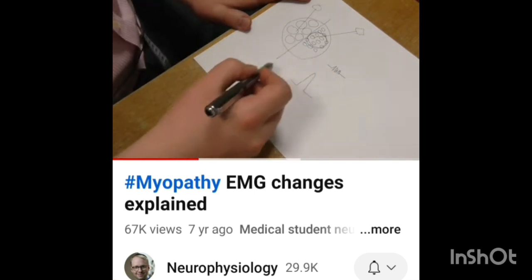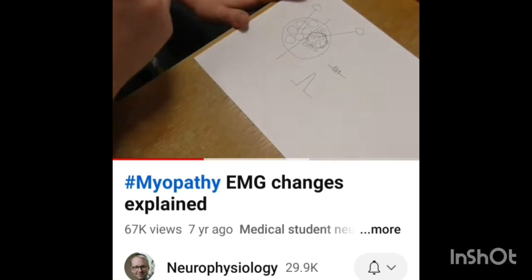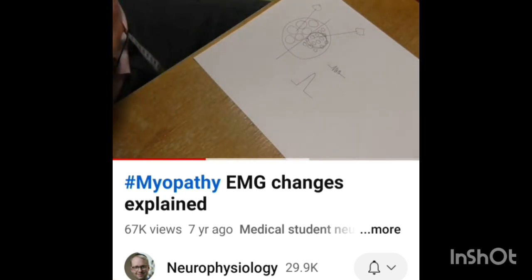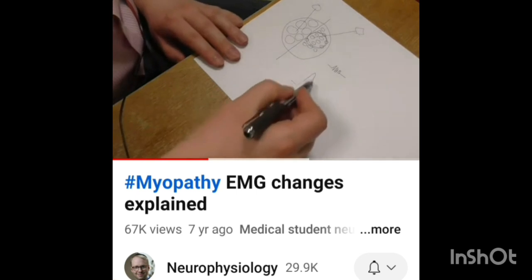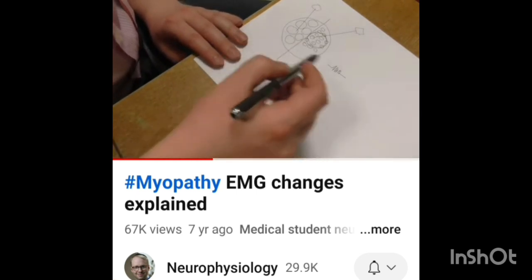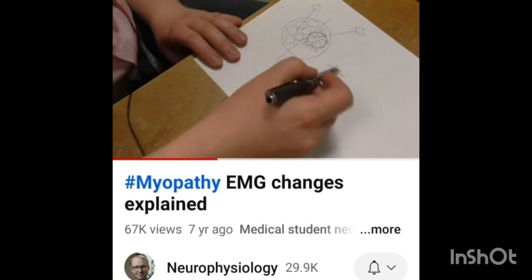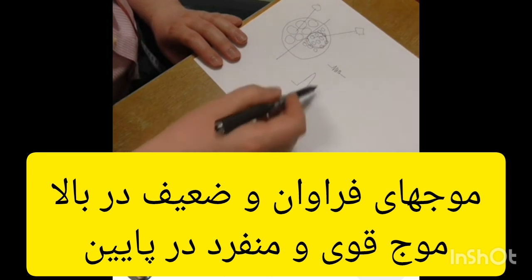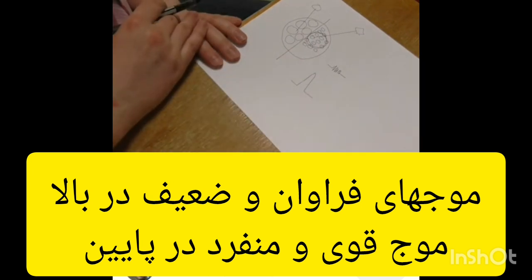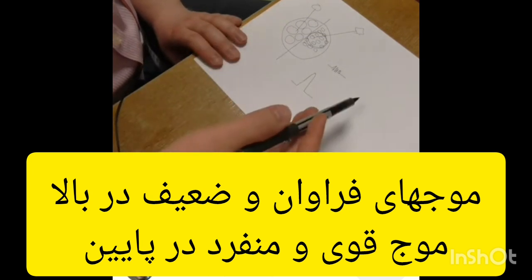So in a normal situation with a normal muscle, we're able to pick up with a green concentric needle electrode between 5 and 7 muscle fiber activities, and they'll summate to this motor unit action potential like so. In the disease state with myopathy, we're going to pick up lots of small motor unit action potentials which look polyphasic as opposed to this large motor unit action potential. We are then looking at how the muscle generates force.